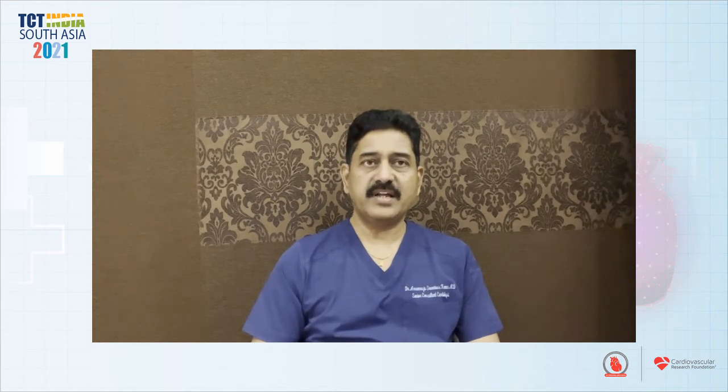The other important thing which was different with the Raj Makkar center was effective utility of transesophageal echo guidance throughout the procedure. This, he felt, is very important, especially in patients with severe LV dysfunction and patients with difficult calcified anatomies, unusual anatomies. It will help us in proper positioning of the valve. And it was also shown effectively that the valve positioning and the minimal paravalvular leak which was left after the procedure was again sealed off with 1 ml more dilatation of the valve. So all these were effectively demonstrated by the transesophageal echo guidance.